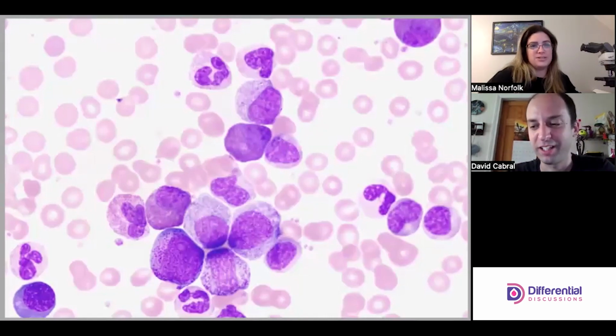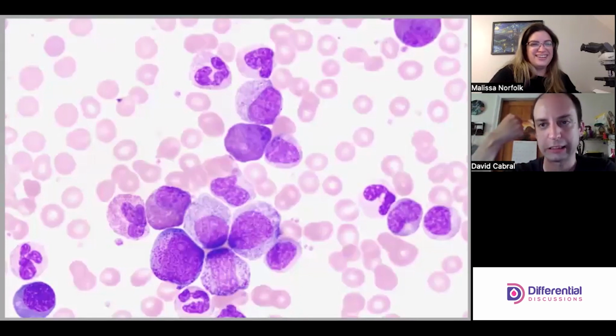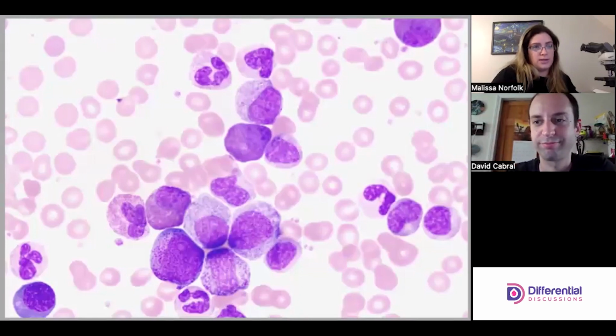Yep, t(9;22). For those of you that are going to take a certification exam, you want those numbers and you want to associate them with CML. Yep, CML, t(9;22), Philadelphia chromosome, BCR-ABL. All of those. And usually your professors will harp on it. I hope so. It's just easy points. You don't want to miss that question, that's for sure.